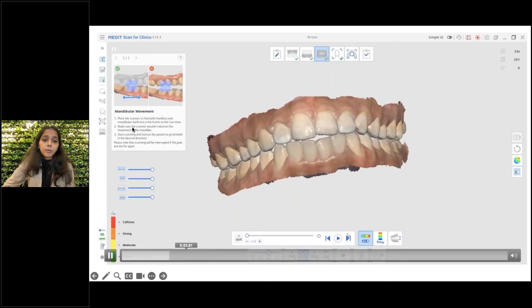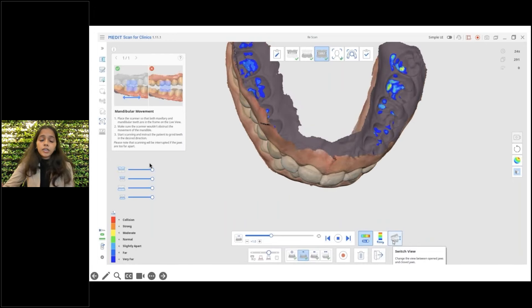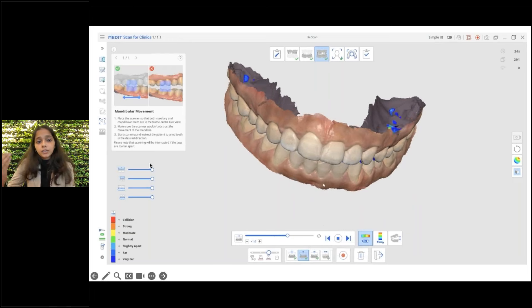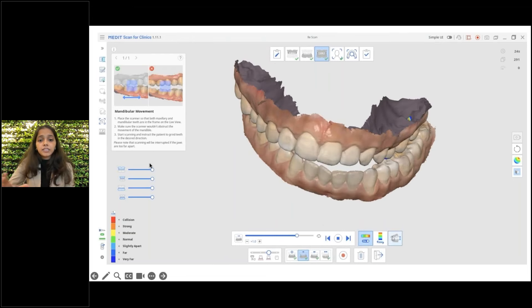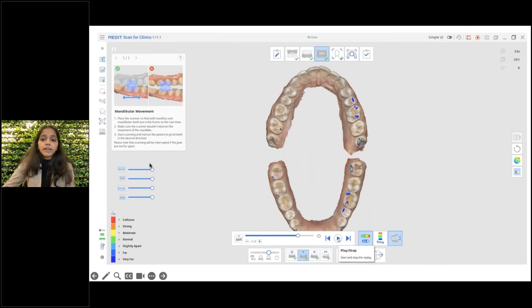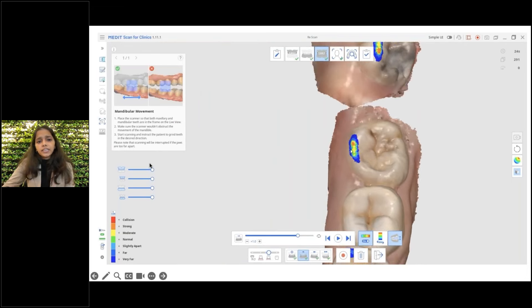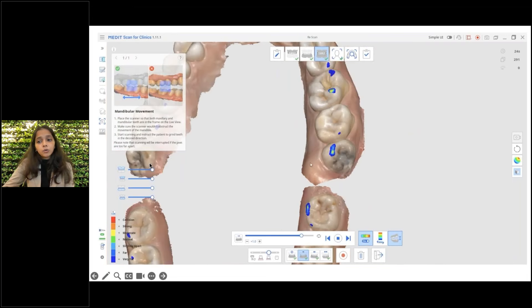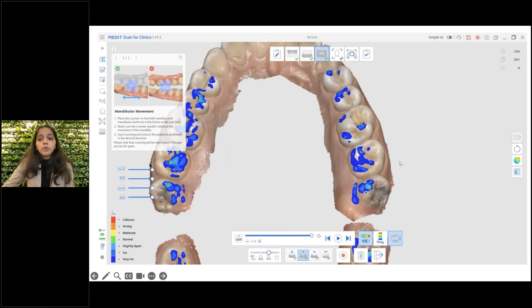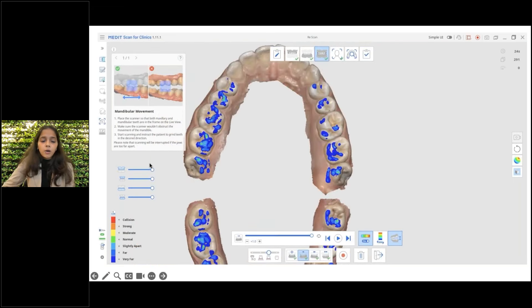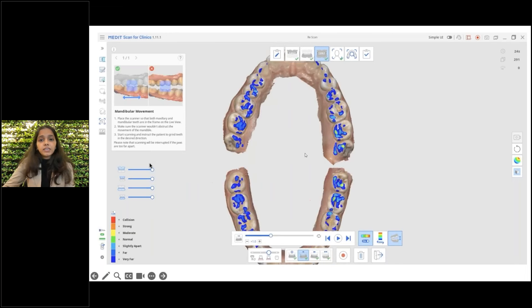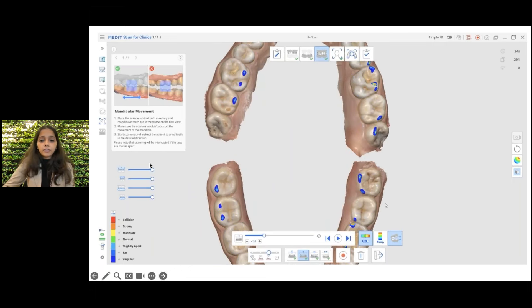Once you record that, you can check the deviation in the occlusal map. In the occlusal map you get different colors: blue indicates there is no contact between the arches; red, green, and yellow indicate various contacts at different measurements — the values are already indicated in the occlusal map. The mandibular movement tool will only be enabled once you have recorded the maxillary and mandibular data with the first and second bite aligned with each other.